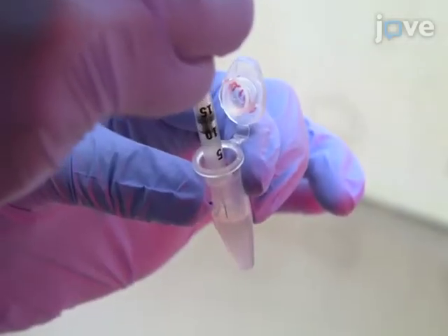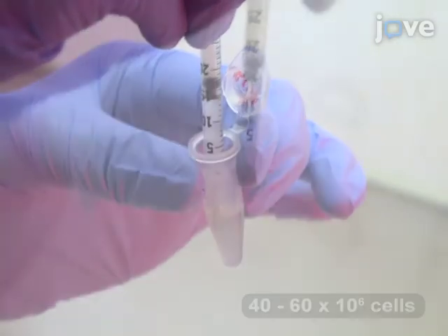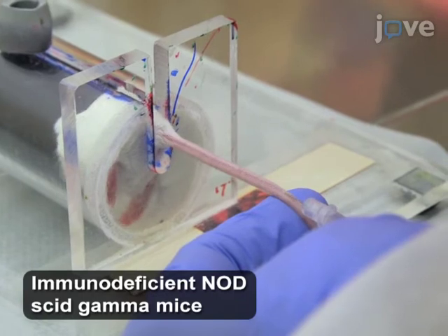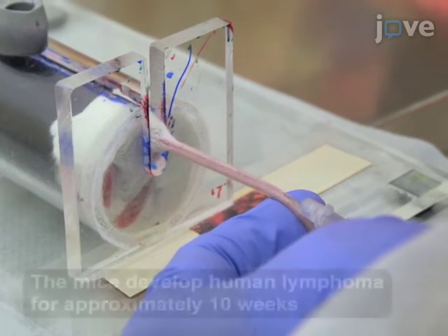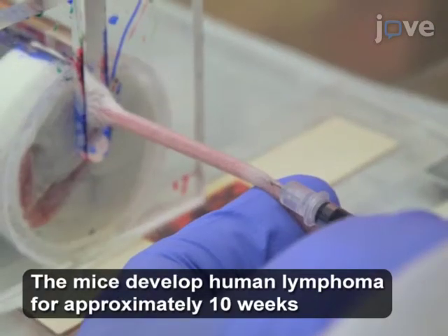Suspend the cells in 150 microliters of single-strength phosphate-buffered saline. Then inject the cell suspension intravenously in the tail vein of 6 to 7-week-old mice, irrespective of their gender. Injecting of the lymphoma cells isolated from patient-derived blood intravenously into the tail vein of the mouse is also critical to ensure successful engraftment.